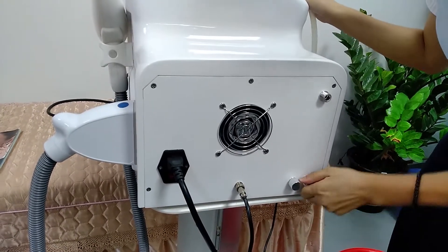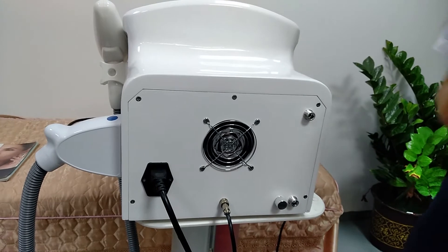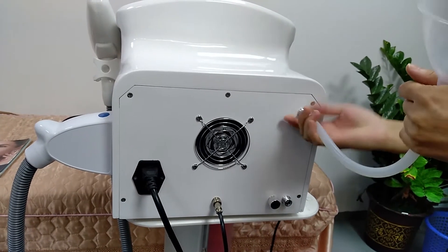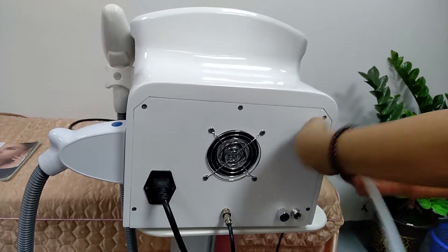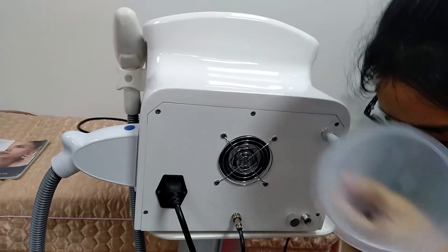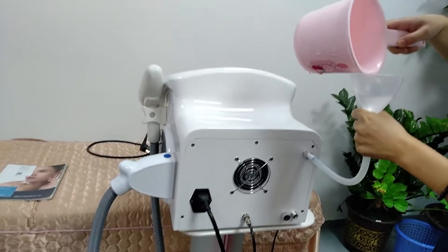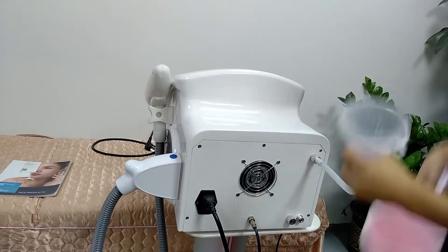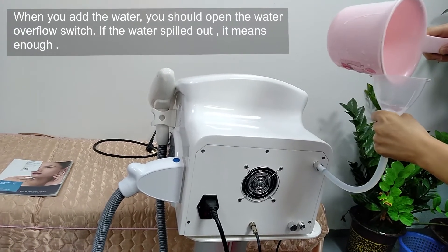Okay, and now we can open it. We open the overflow, and now we can start to add water. First, we need to connect the fitting on the water inlet, and now add the water.